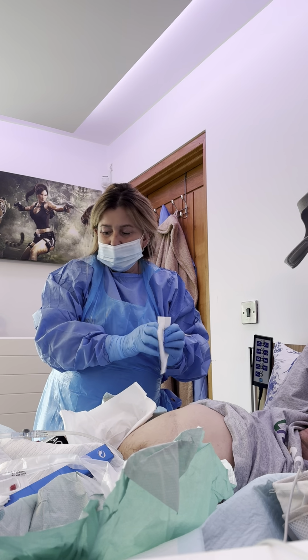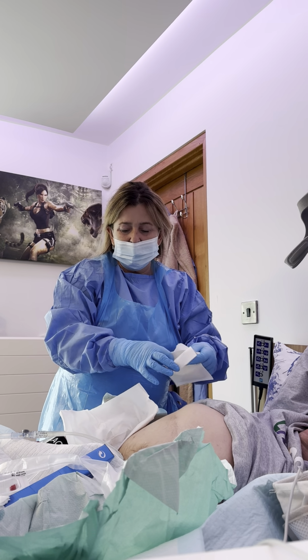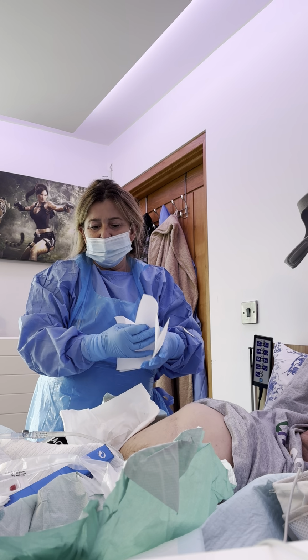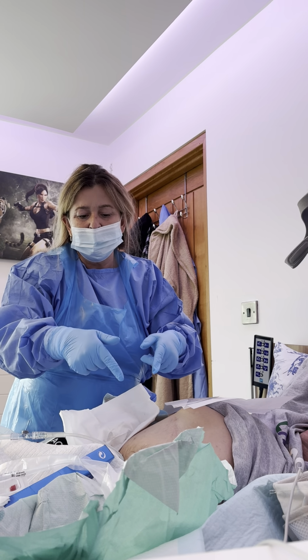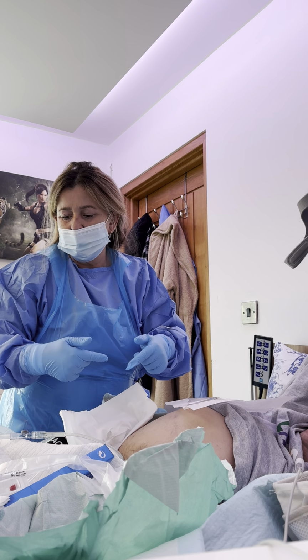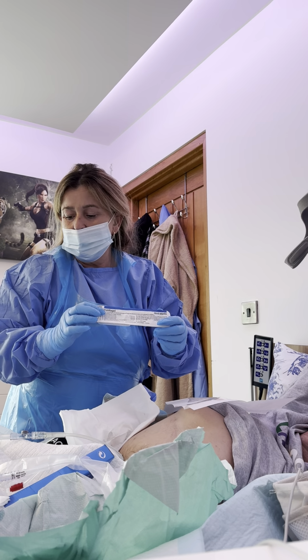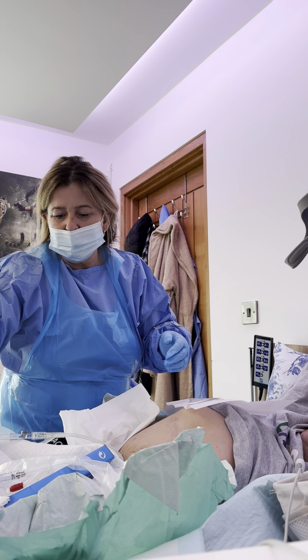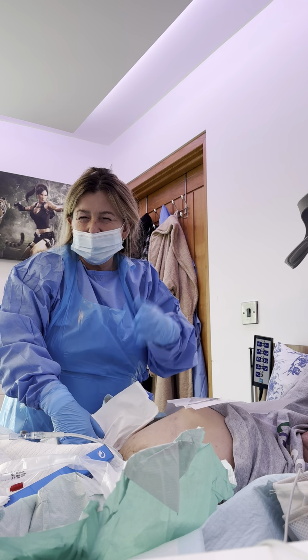Normally I would set out a load of sterilised gloves. These are sterilised. I'm going to be using Instillagel. I've got everything here ready. I've got new saline water to inflate the balloon. The Instillagel numbs the area, but it's not that brilliant for spinal injuries, but it still helps take the catheter through. Once I pull this out in a second, I need a dirty hand.